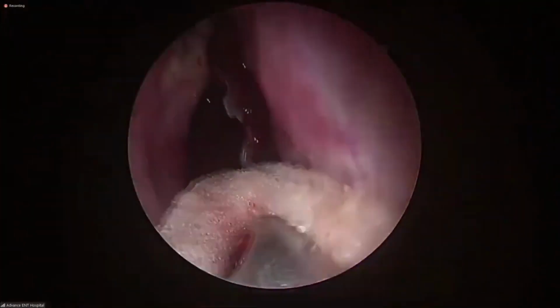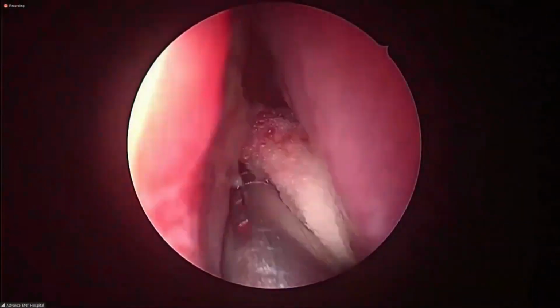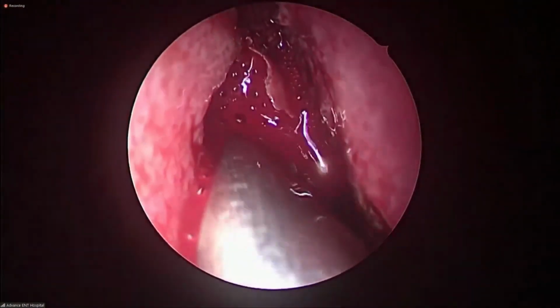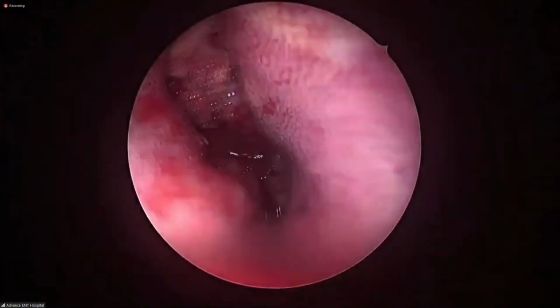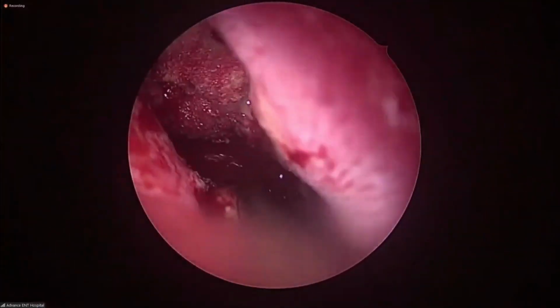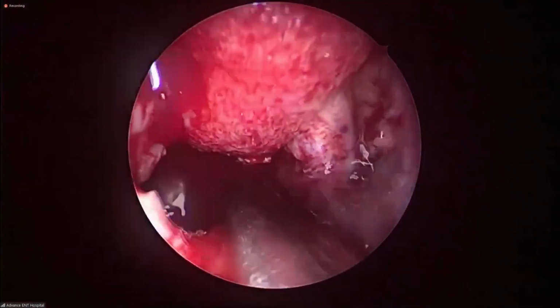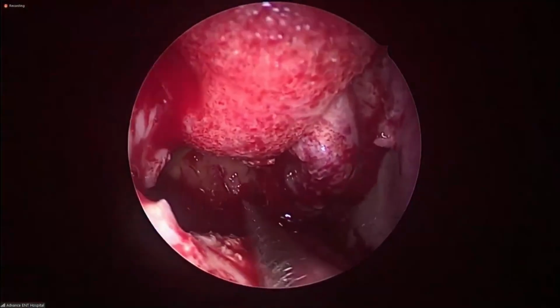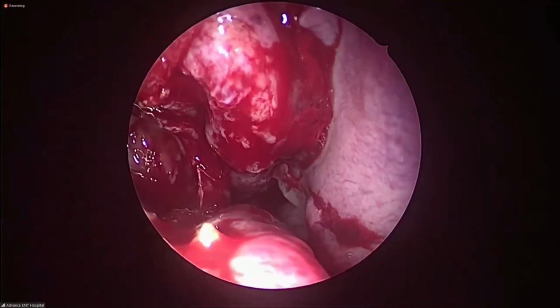Our challenge is the frontal here. Yes, sir. As you mentioned earlier, on the right side. Yes, that's why I took up the right side first. In spite of the deviation, we may not show both sides. Time is constant, so at least we should show the important side. Okay, sir. So this is going to be the last case, looking at the time.